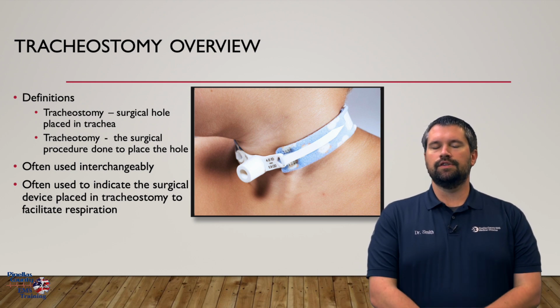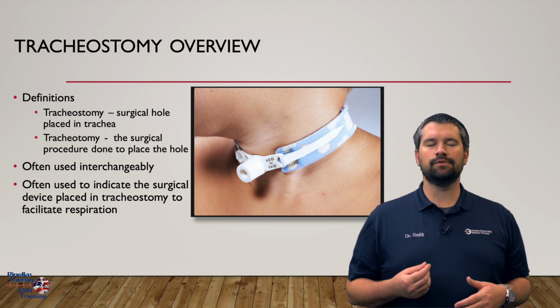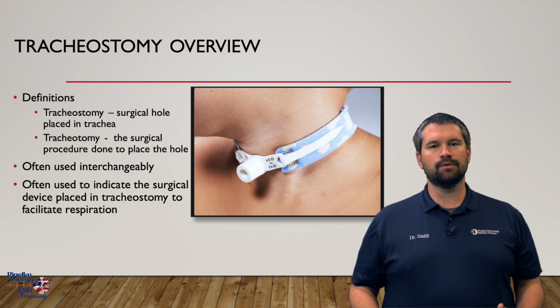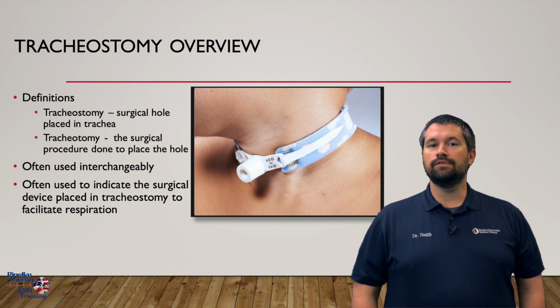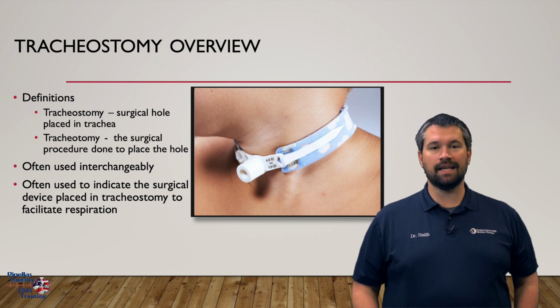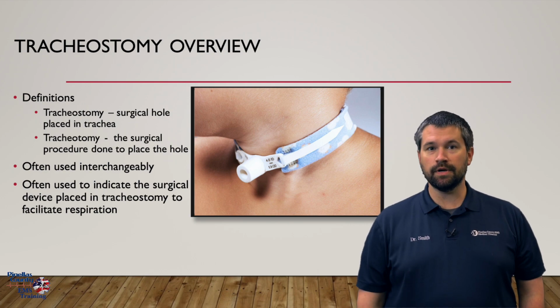So there's actually two definitions and two words that we commonly use interchangeably. First off, tracheostomy actually refers to the surgical hole that's placed in the trachea. The tracheotomy itself is the procedure that's done to place that hole. However, in medicine, we often use these two terms interchangeably. It really doesn't matter. And in fact, we often use these terms to indicate the actual device itself that is placed in the hole to help facilitate respirations.